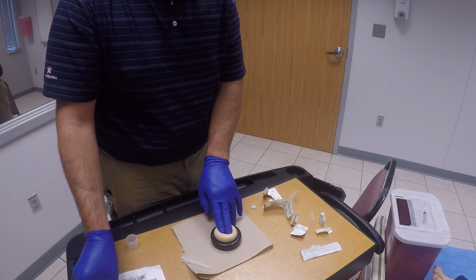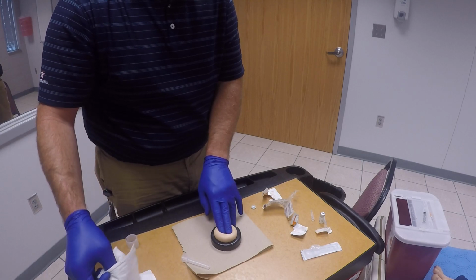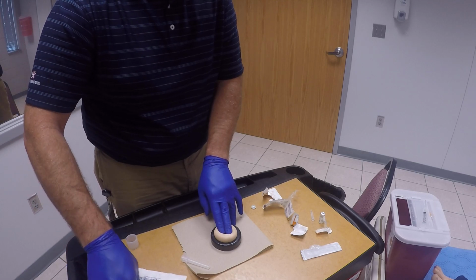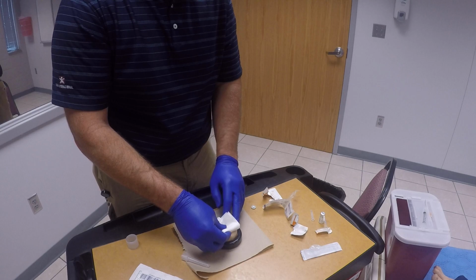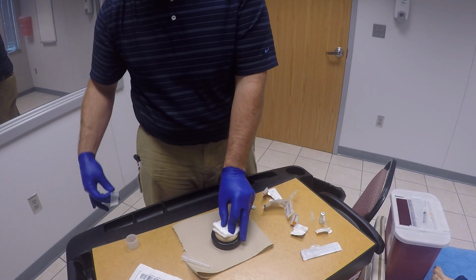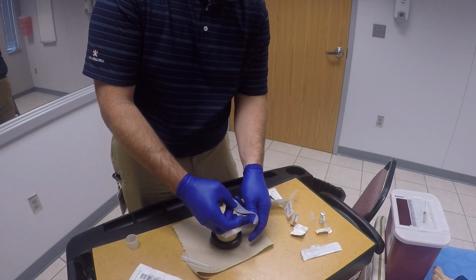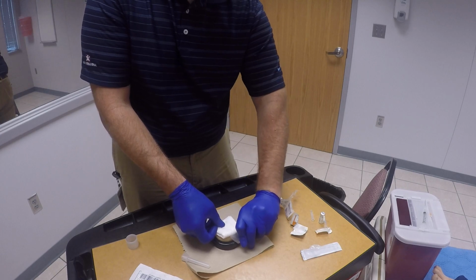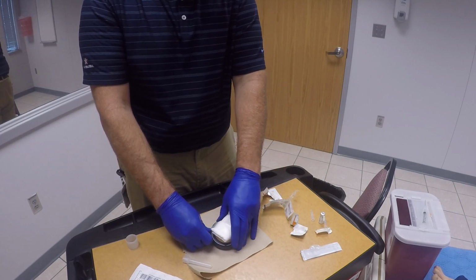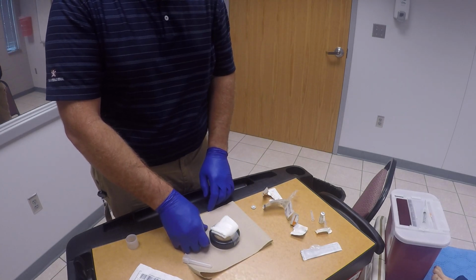Go ahead and take your 4x4s or whatever kind of gauze you might be using. And then you'll cover that site. If you want to just use a Band-Aid, that's possible too. That would be appropriate. And then you'll secure it down. And then you want to check your patient of course, for any adverse reactions and that you are getting the desired effect of the medication.